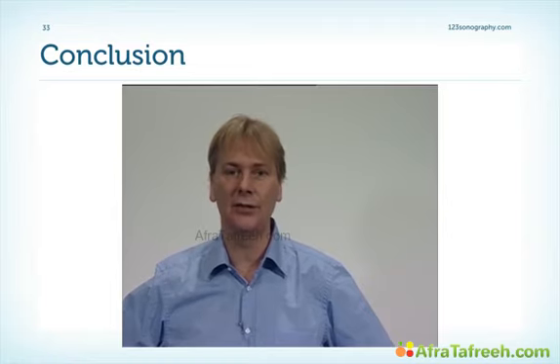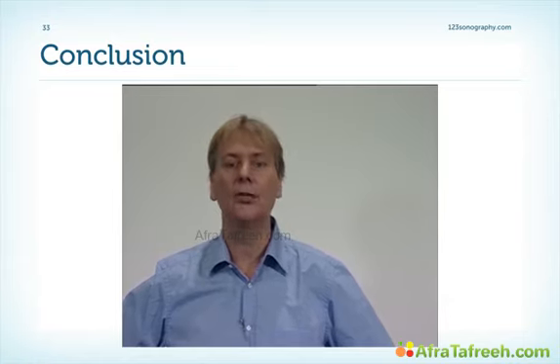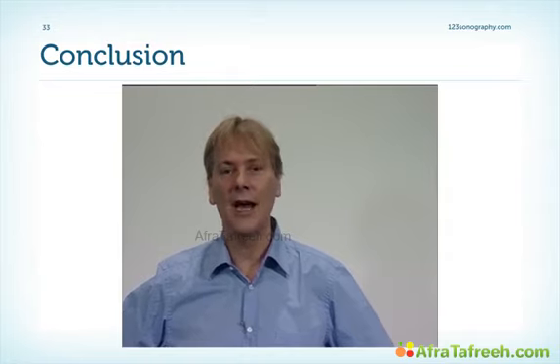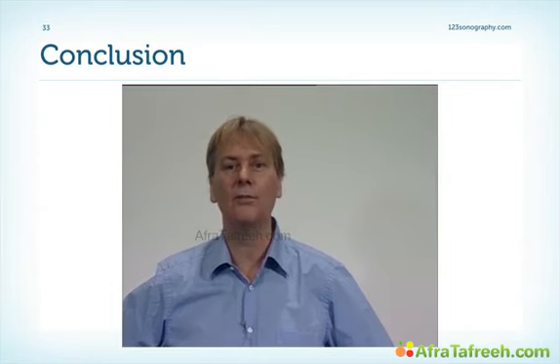In conclusion, I want to again emphasize the importance of the typical clinical findings in patients with pericardial constriction, peripheral edema, and signs which are compatible with right heart failure. If you cannot find an explanation for these symptoms, you have to suspect pericardial constriction. And then you have to use all the tools which are available to you. Echo tools, but also MRI, CT, and up front also cath studies. And keep in mind, some patients might be volume depleted, especially if they receive diuretics. In these patients, the symptoms and typical findings might not be as prominent as in patients who have full-blown pericardial constriction.